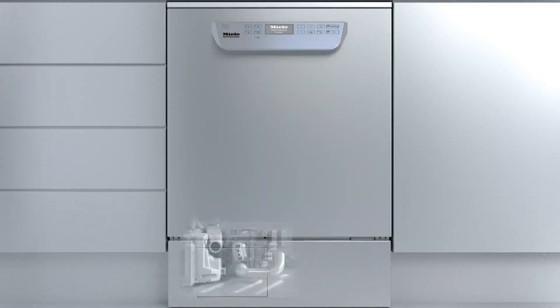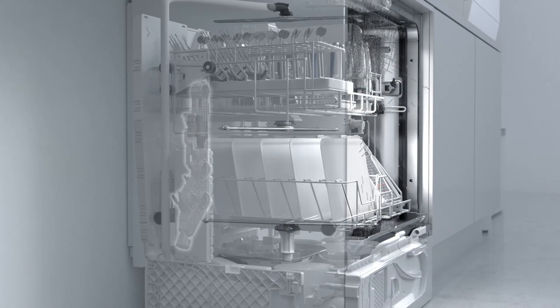This is facilitated by the use of a variable speed pump, rear docking technology and new spray arms.